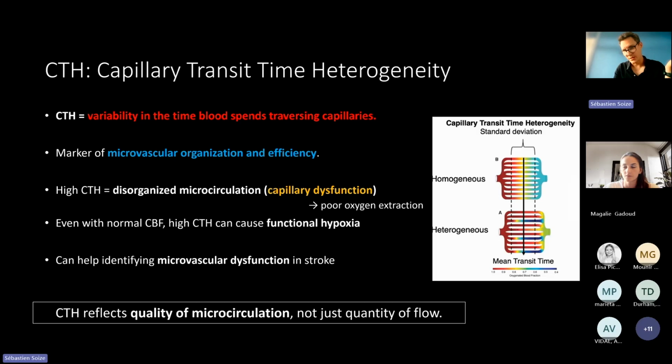There will probably be some future study on that. Doing CBCT after recanalization and see whether we still need to go further with intra-arterial injection of some thrombolysis, like recently the CHOICE-2 study highlighted the benefit.